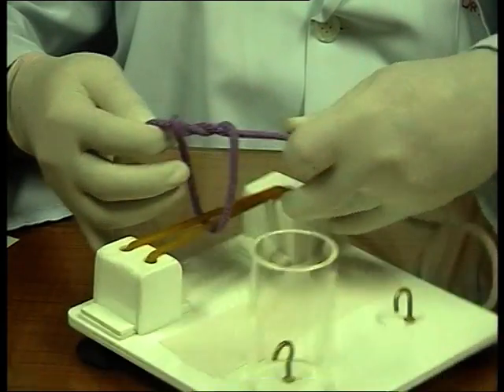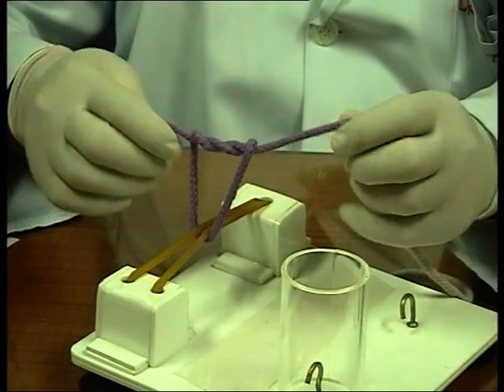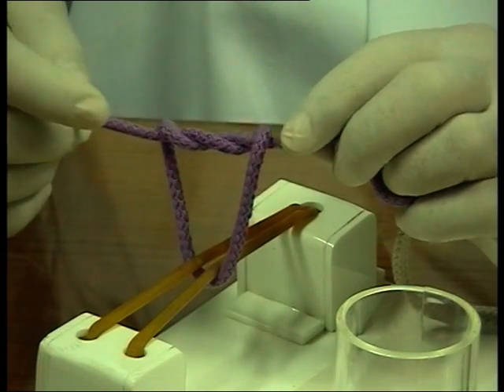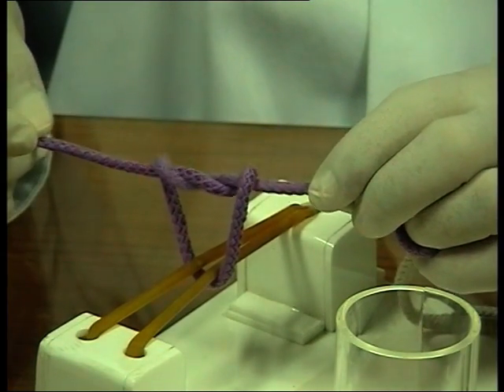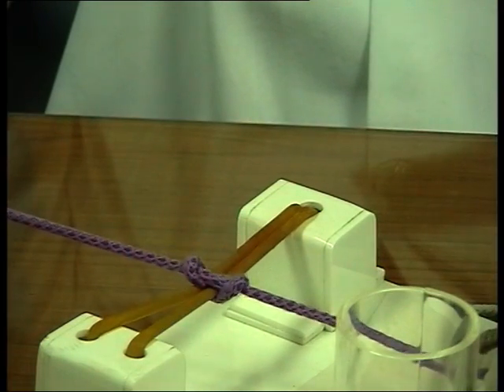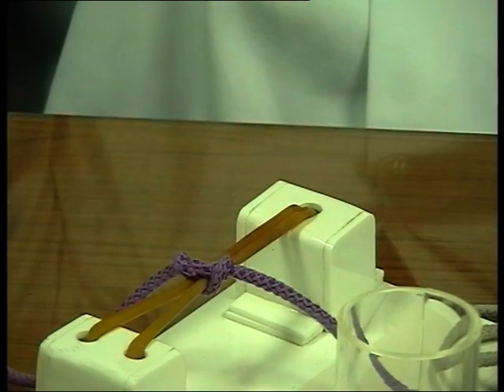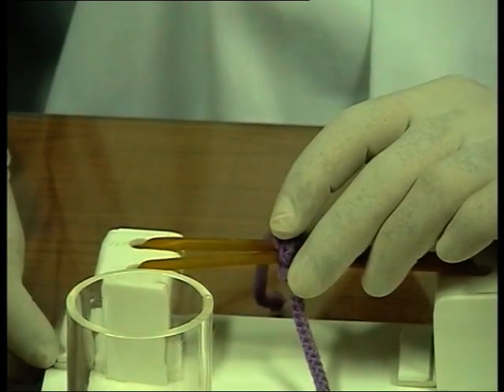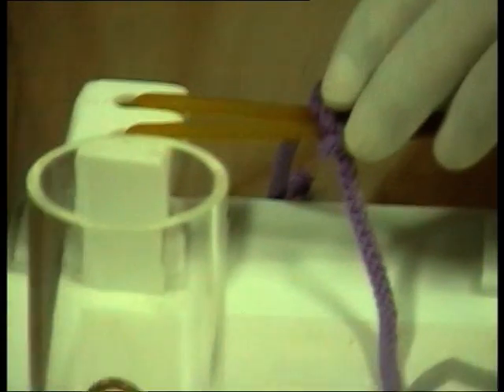Now if you watch, I would like you to zoom here. These are the two pulleys you must look at, which are taking the throw down like a noose. You can go nowhere now. Could you take these two pulleys, or do you want me to show it again?